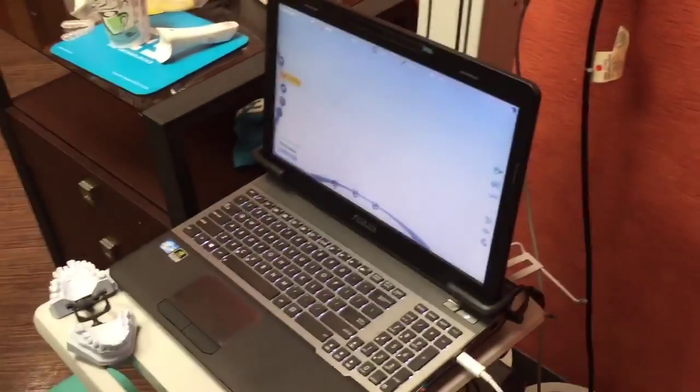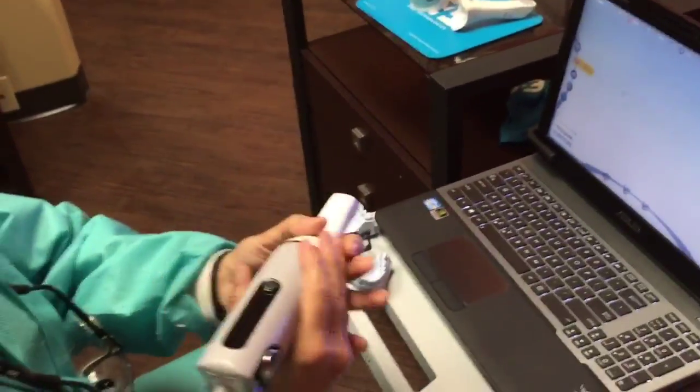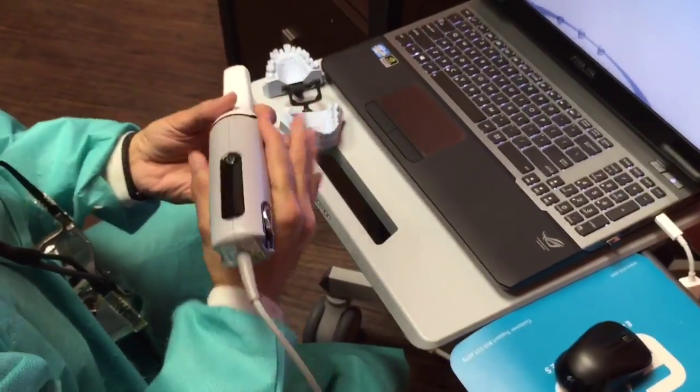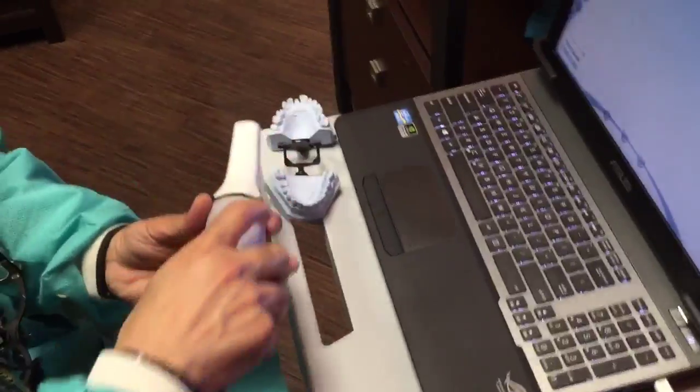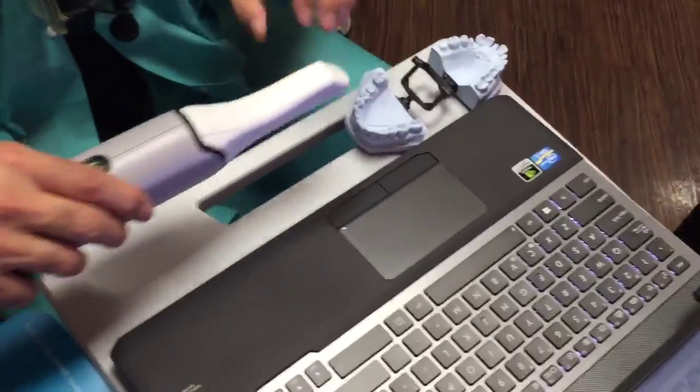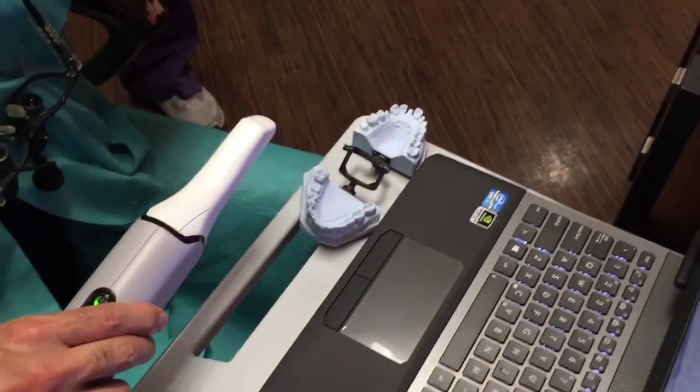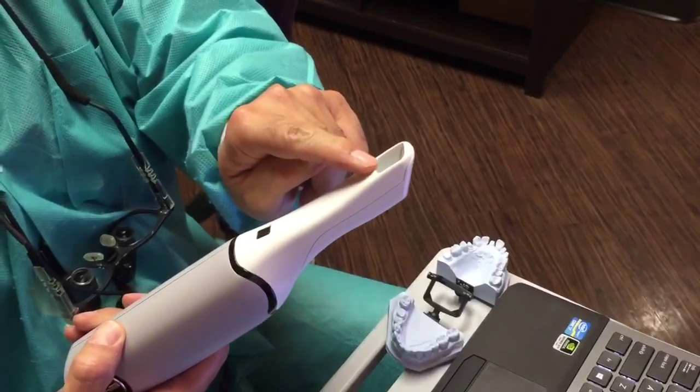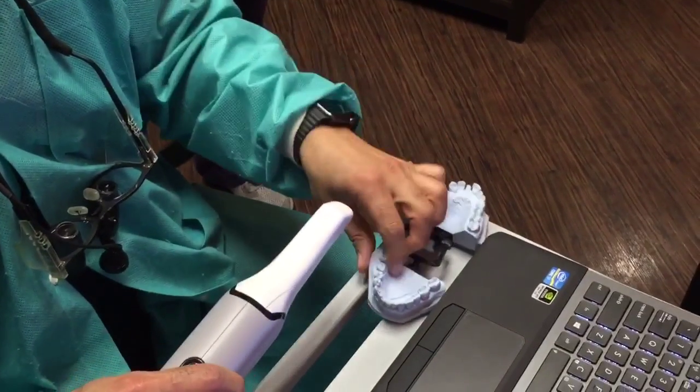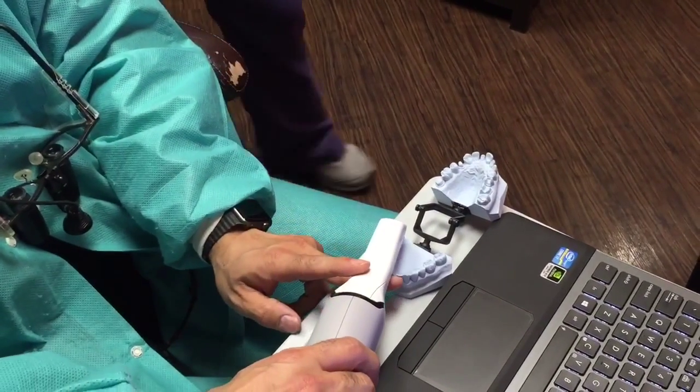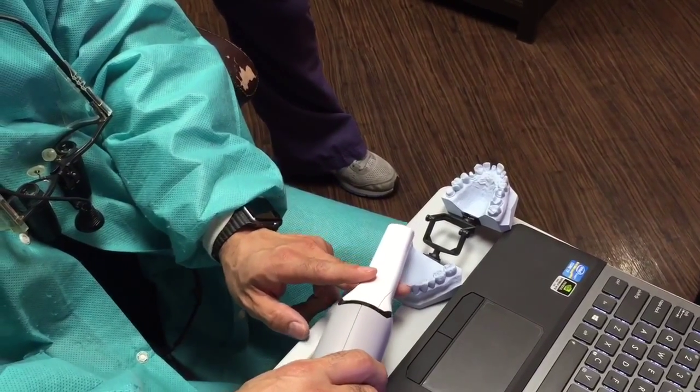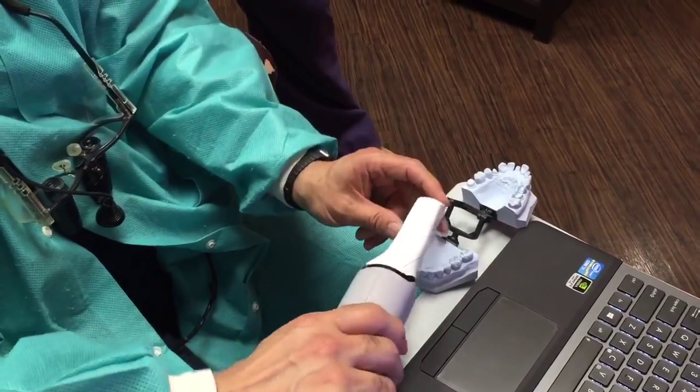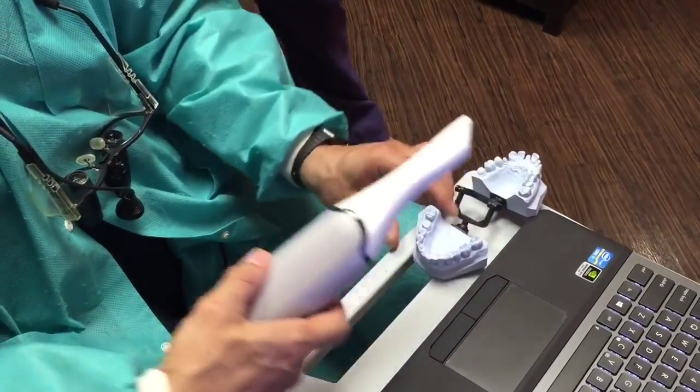So now I'm going to go to the prep because the tooth is already prepped. So I skip that step. Then I plug my scanner. And you've got to be very careful. This is like $20,000. So you don't bang it around. Don't drop it. Like a pen, or whichever way. But they have videos. I want you guys to watch the videos. So you press the power button. When you come in the mouth, you have to make sure that little isolation that we have, the white thing, the suction, keeps the tongue out of the way. It takes the moisture out of the mouth because there's a mirror here. If it fogs it up, then it's hard to capture the image.